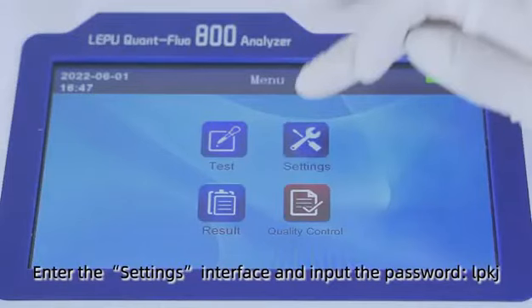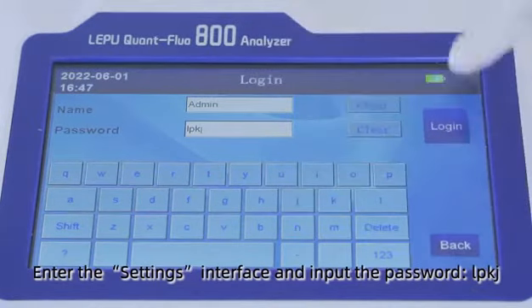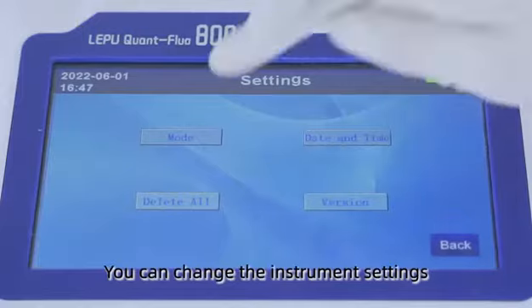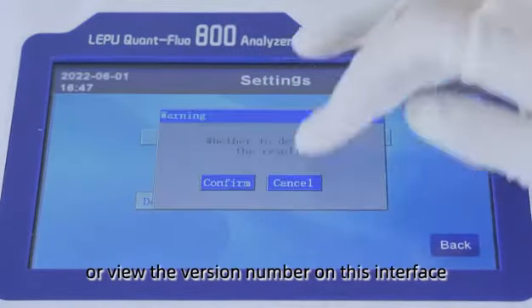Enter the settings interface and input the password LPJK. You can change the instrument settings or view the version number on this interface.